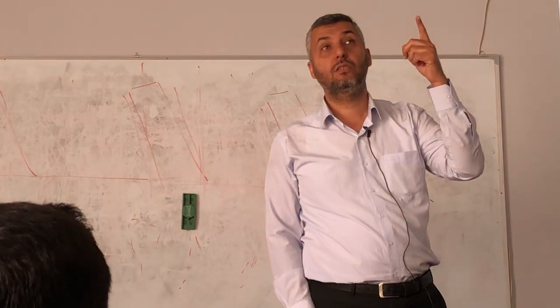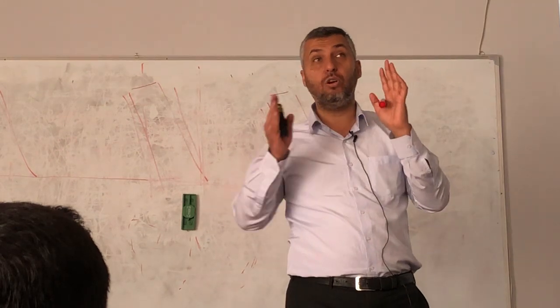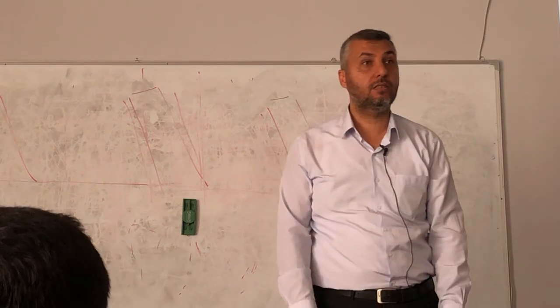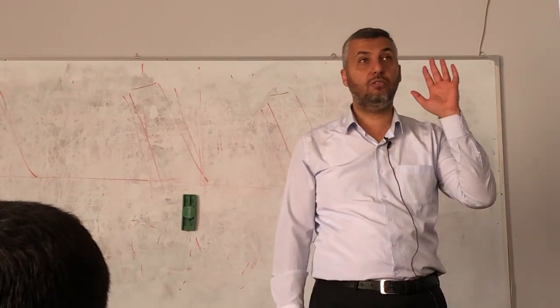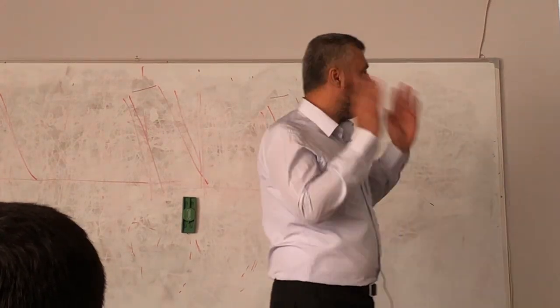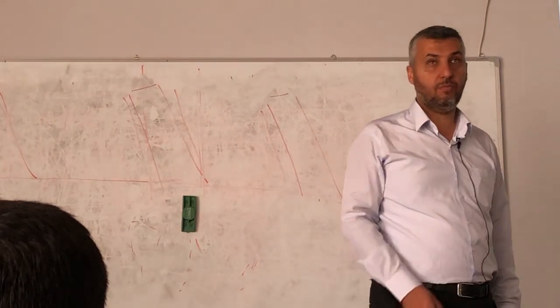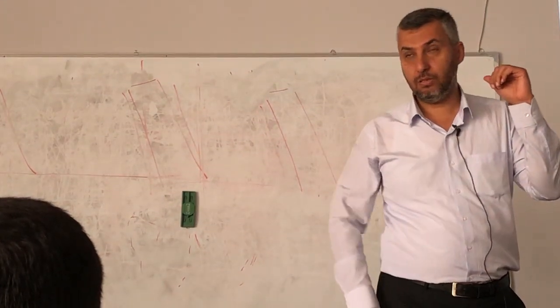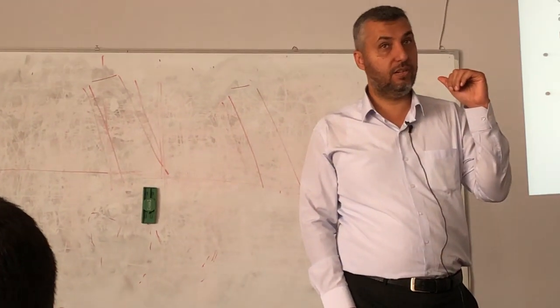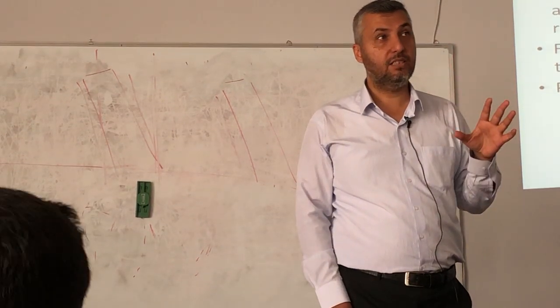By surveyor. We are talking about the surveyor, 2 or 3 lectures, all of them about the surveyor now. But how by surveyor? By tilting the cast. Only tilting the cast. We tilt the cast until we get the maximum parallel surfaces. Just by tilting the cast. In your lab, all of you saw the surveyor.